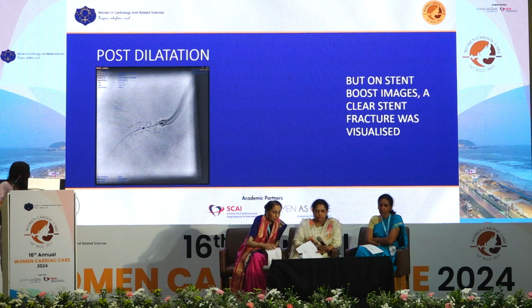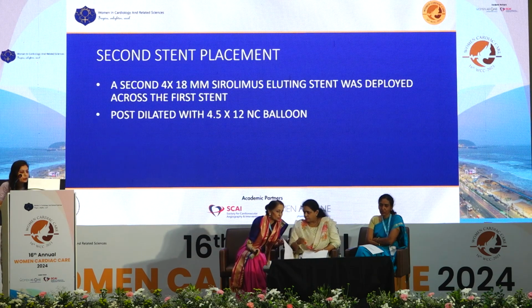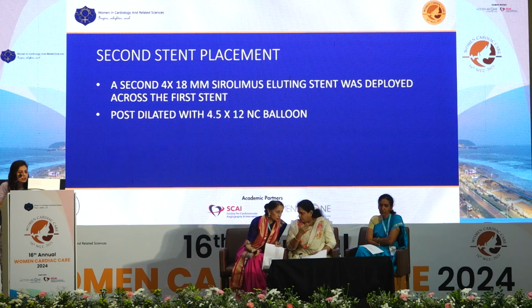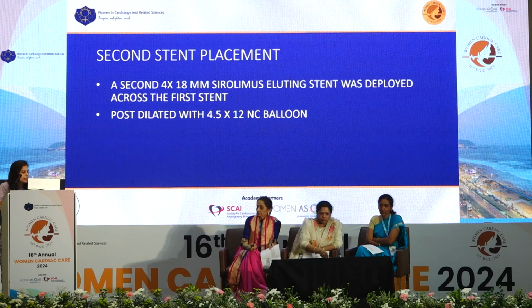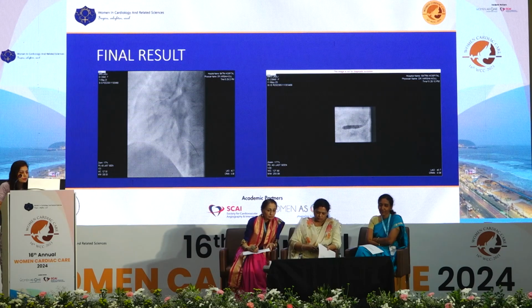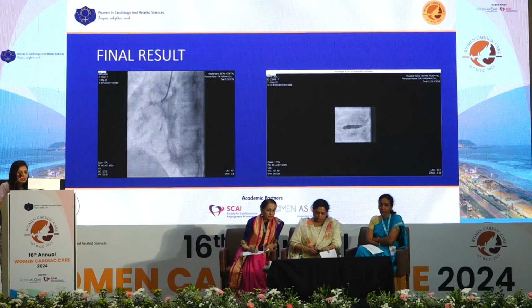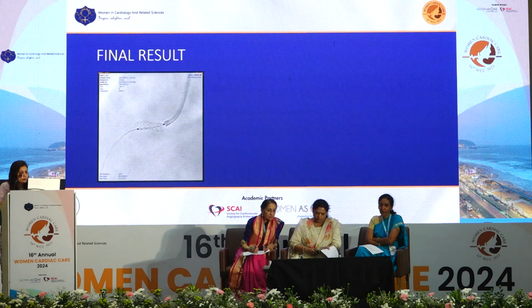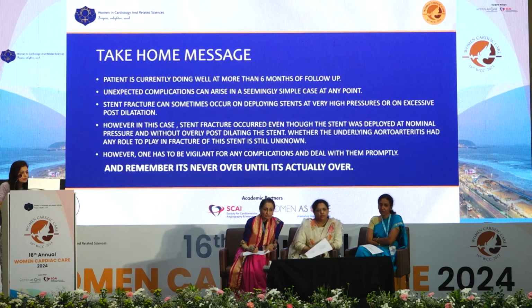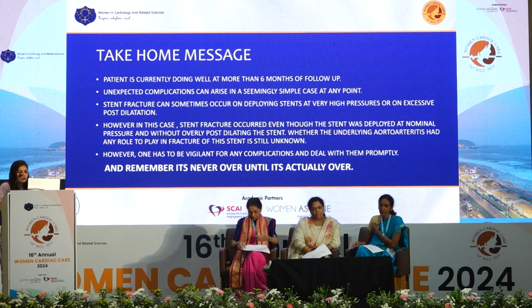Is it visible? So we deployed a second 4 x 18 mm sirolimus eluting stent across the first stent, and it was post-dilated with a 4.5 x 12 mm NC balloon. This is the final result and the final stent boost image. Currently, the patient is doing well at more than 6 months of follow-up.